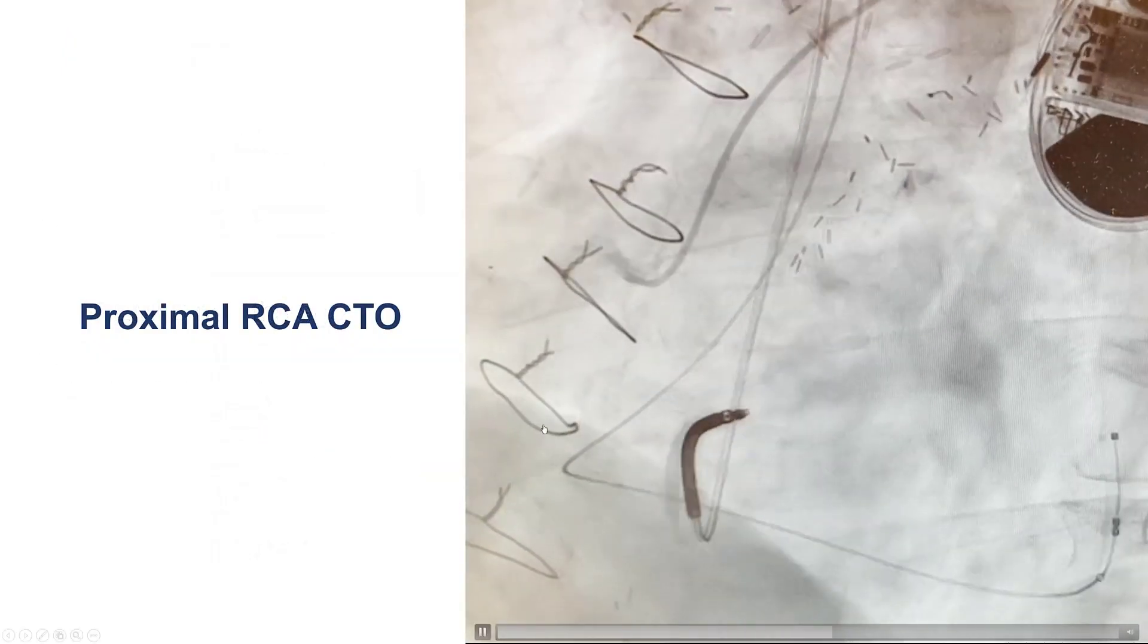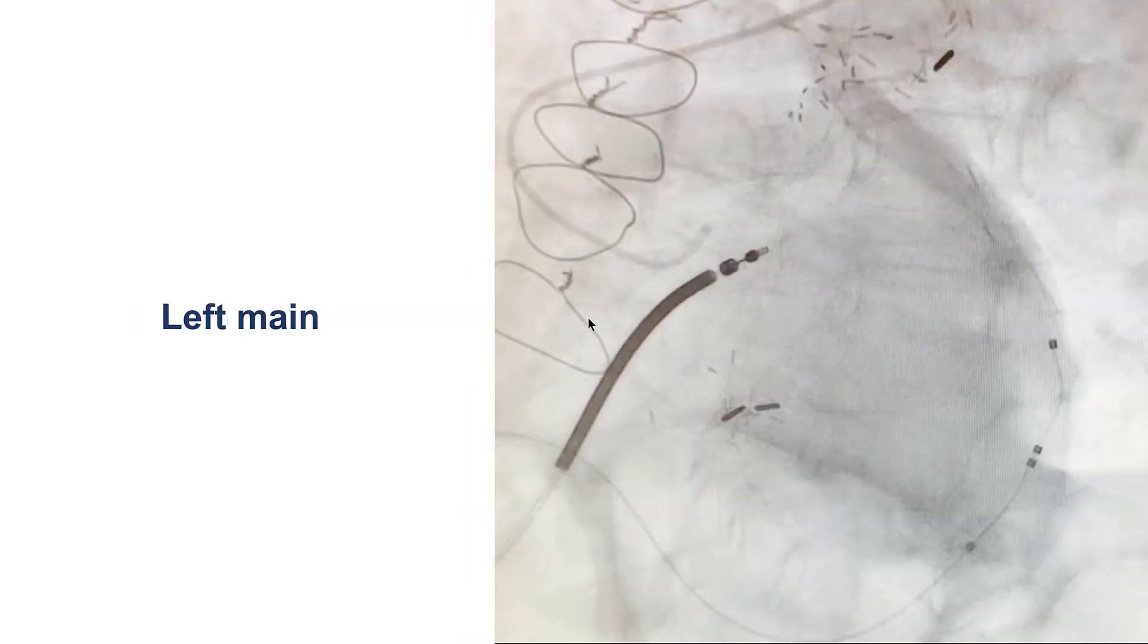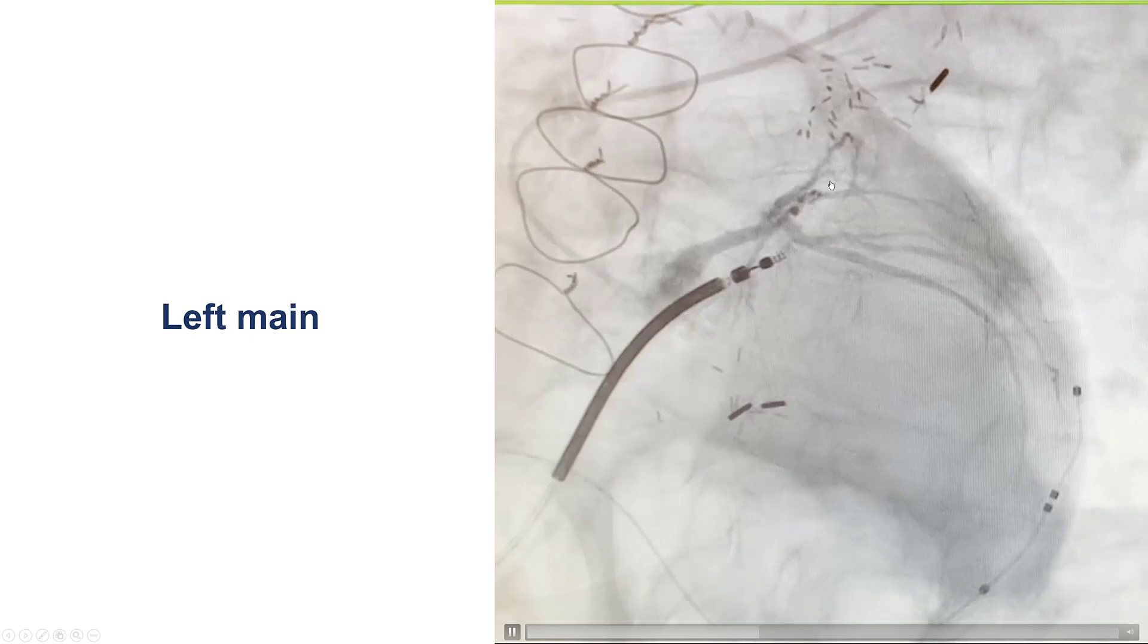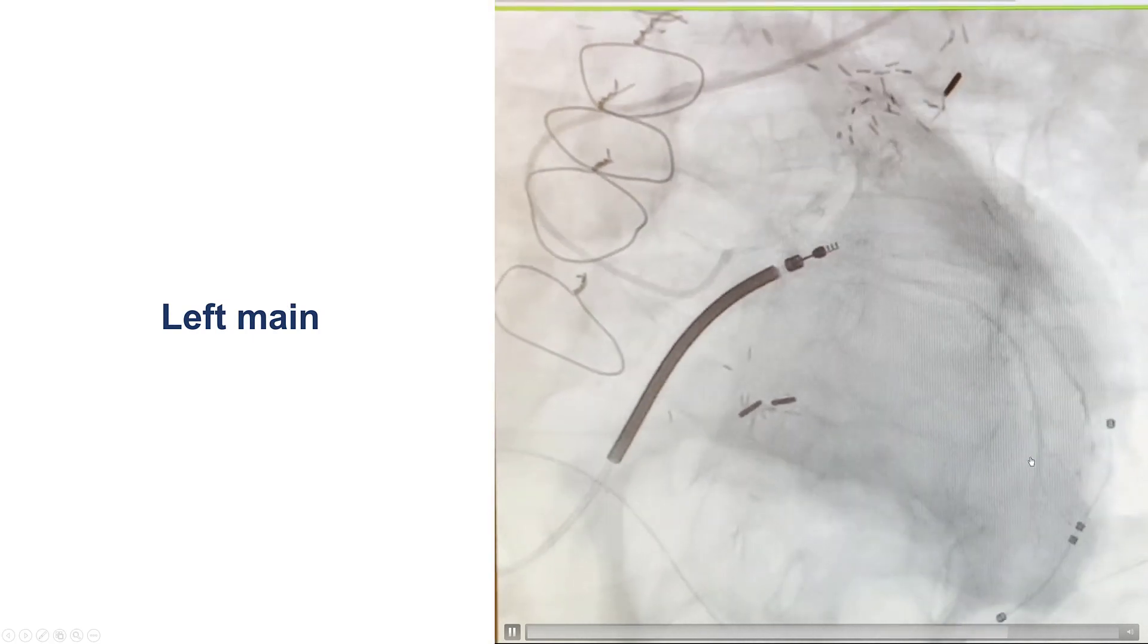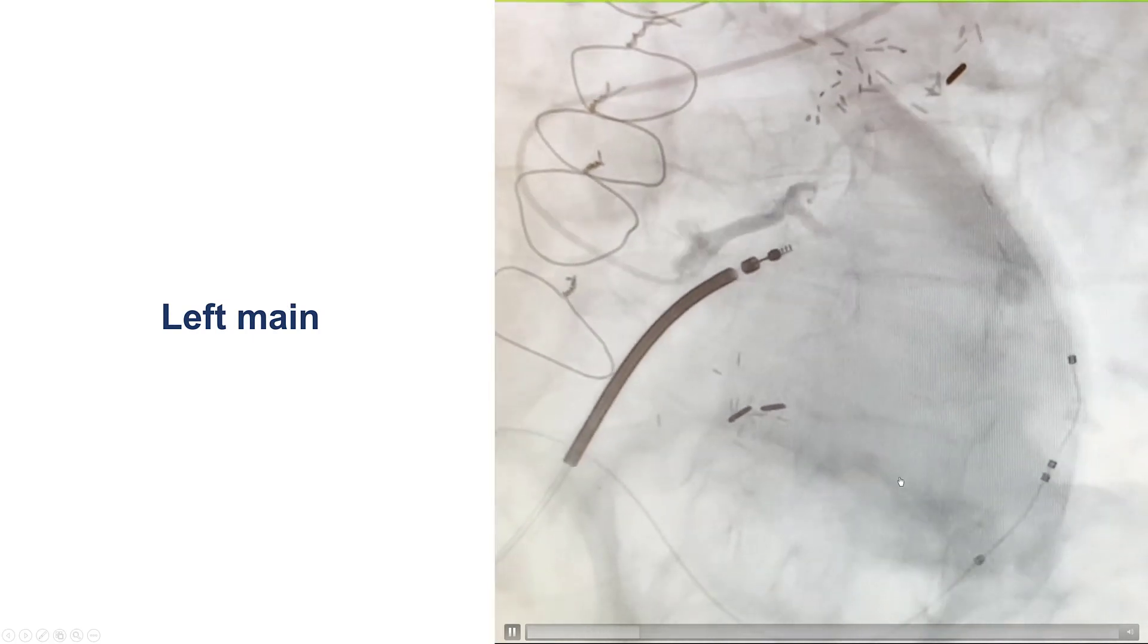This is a diagnostic coronary angiogram that shows a CTO of the proximal right coronary artery with a small branch coming at the tip. The left system was diffusely diseased. There was flow into the circumflex.